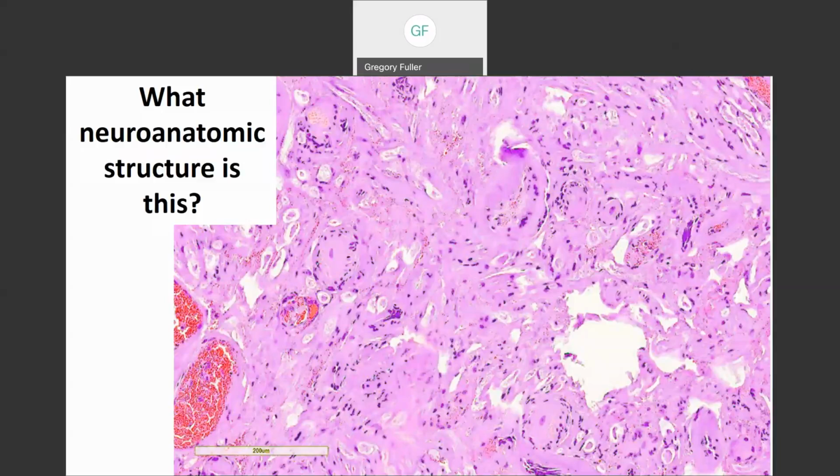Look, this is a real life experience for the surgical pathologist. You're going to have to be able to deal with less than ideal circumstances. And it's possible, depending on the context, that being able to recognize ganglion cells, even distorted ganglion cells, can save you. And knowing that this is peripheral nerve, you see peripheral nerve for anatomic compartment, etc.